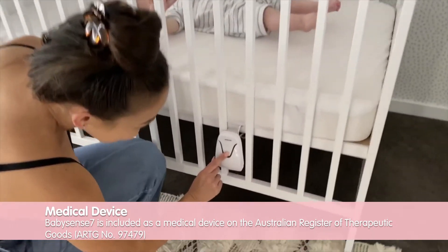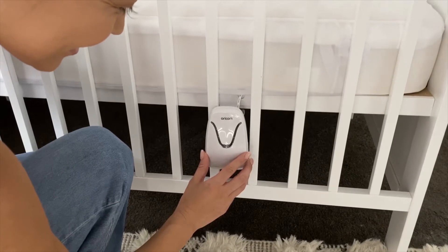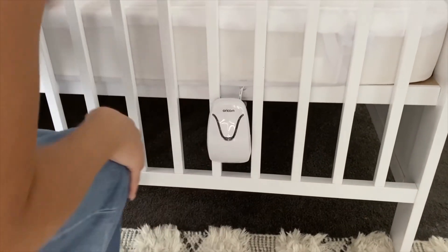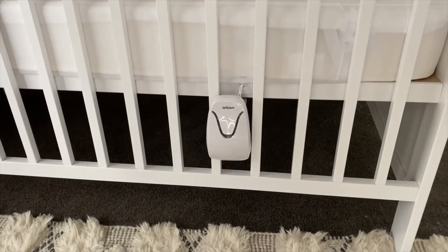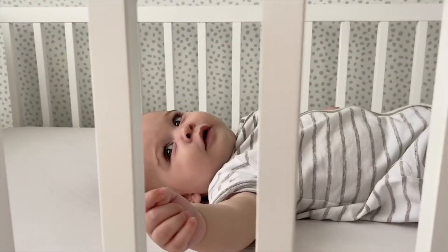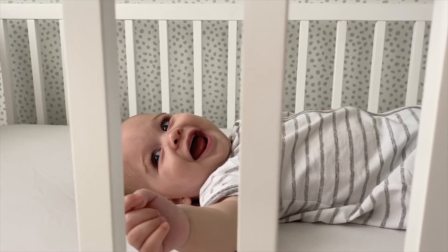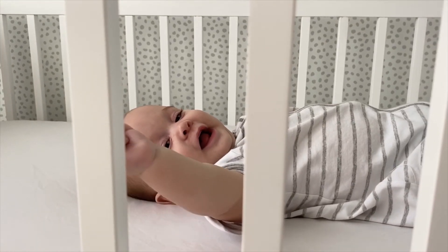Place the mattress back over the top, ensuring full contact with the pads. To operate, you simply place the baby in and press the on-off button. These red control lights will then switch on briefly and a double-click sound will be heard. Then the green movement indicator light shows that the control unit is on and monitoring. Press the same on-off button to turn the device off when baby isn't in the cot. It really is that easy.